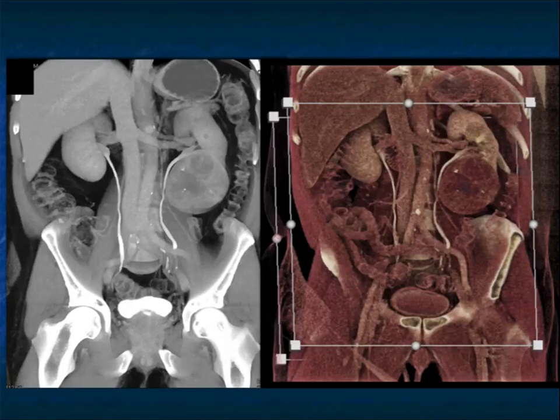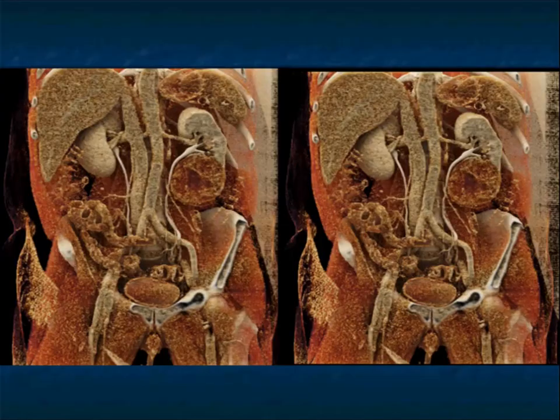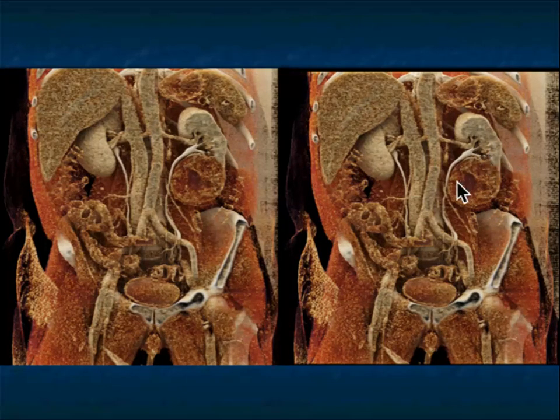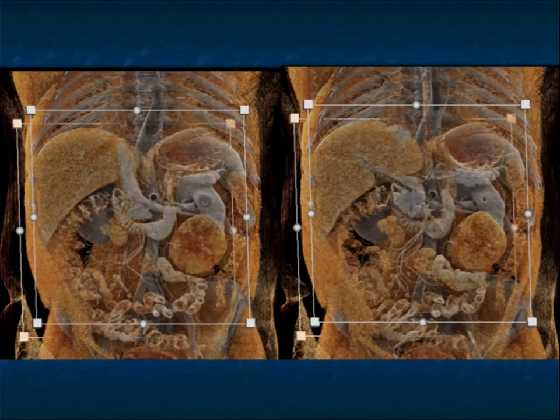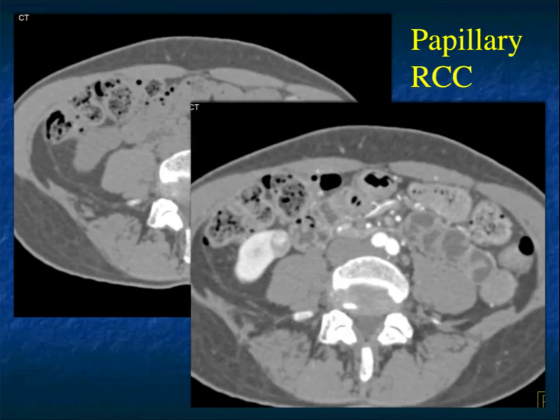Here it is on the excretory phase with both volume rendering and cinematic rendering. On the cinematic, you nicely see the tumor, the central necrosis, normal versus abnormal enhancement, and infiltration of the lower pole of the left kidney by the tumor. Simply changing some parameters gives you a little bit more information.